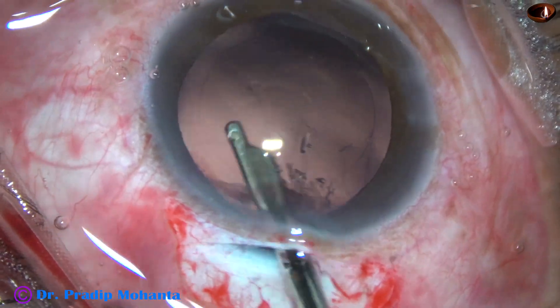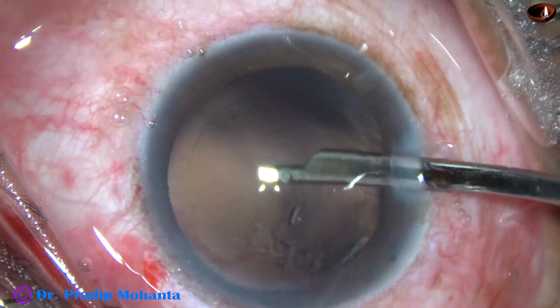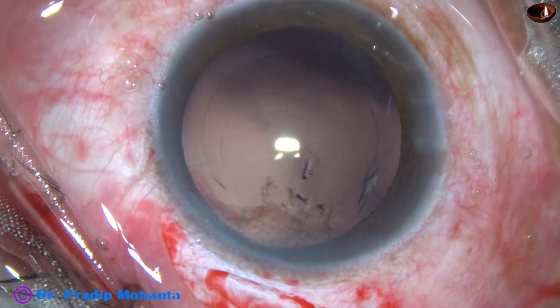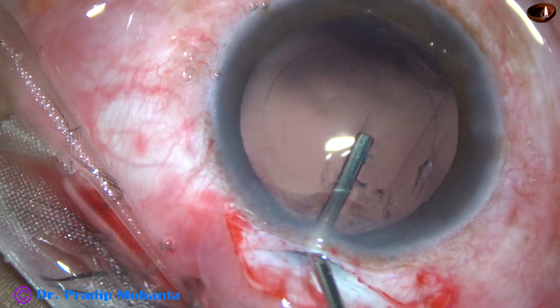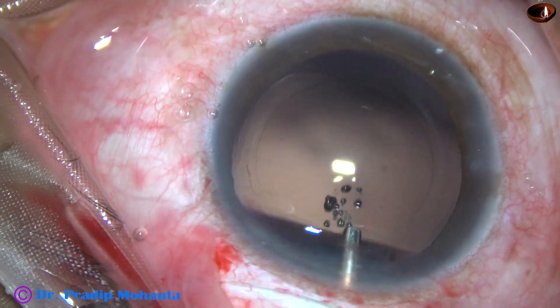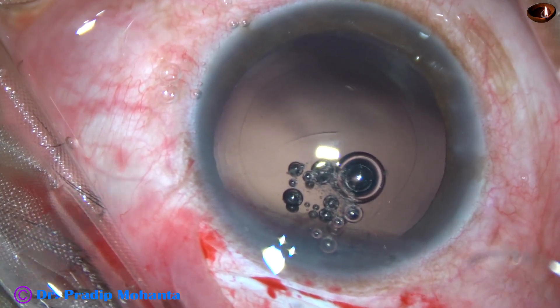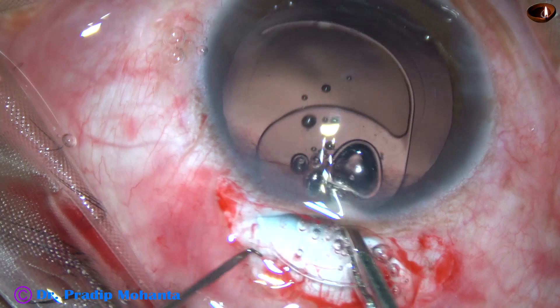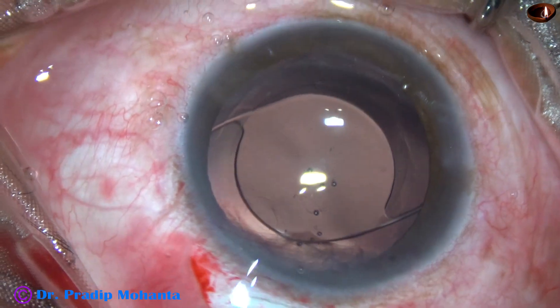Some fibers sticking to the posterior capsule are removed. In this case, I am going to implant a PMMA lens with a 5.25 mm optic — this is the Liberty lens from Appasamy Associates. The leading haptic goes into the capsular bag, and the trailing haptic also goes into the capsular bag.